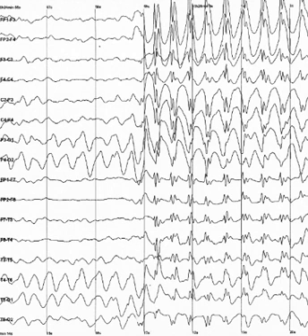Similarly, simultaneous recordings with MEG and EEG have also been conducted, which has several advantages over using either technique alone. EEG requires accurate information about certain aspects of the skull that can only be estimated, such as skull radius, and conductivities of various skull locations. MEG does not have this issue, and a simultaneous analysis allows this to be corrected for. MEG and EEG both detect activity below the surface of the cortex very poorly, and like EEG, the level of error increases with the depth below the surface of the cortex one attempts to examine.